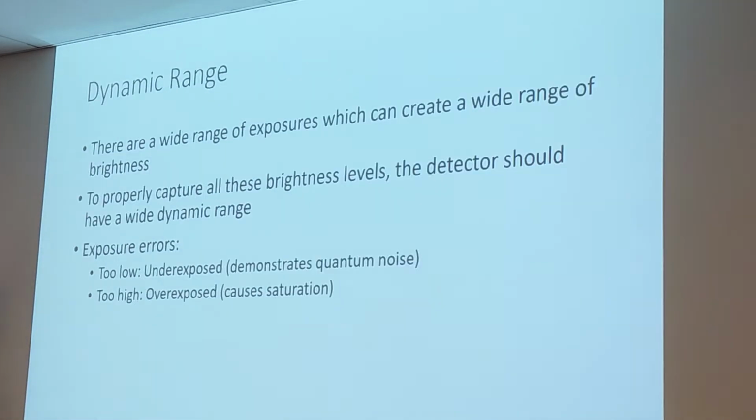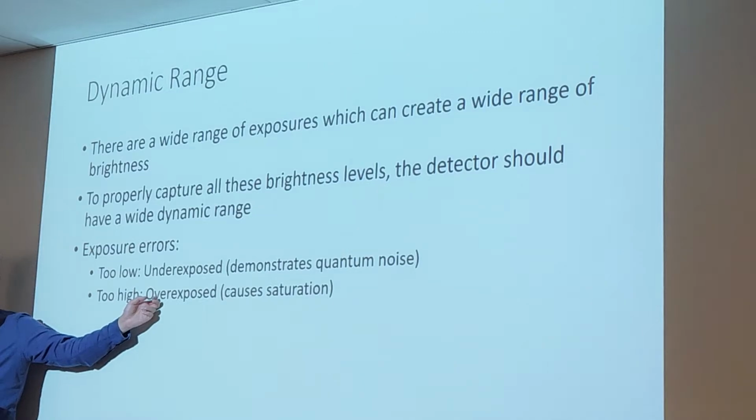Can detectors that become too old or broken start causing saturation? So this has to deal, once again, with dynamic range. Usually the issue isn't going to be that the detector has gotten too old that its dynamic range has decreased. This is more like looking at film screen. It's like film screen, you used slightly too many X-rays, too bad. It's saturated now, overexposed, image looks too black.